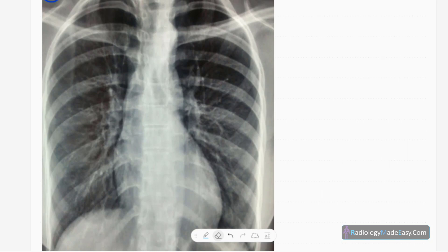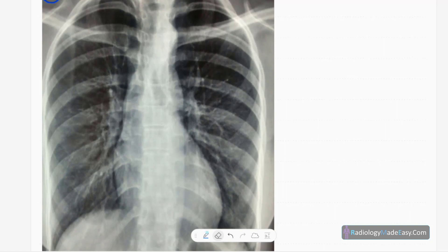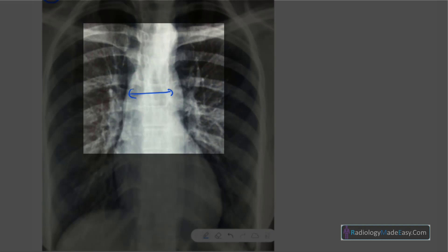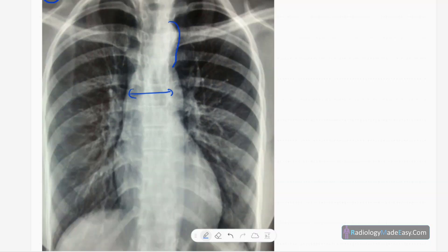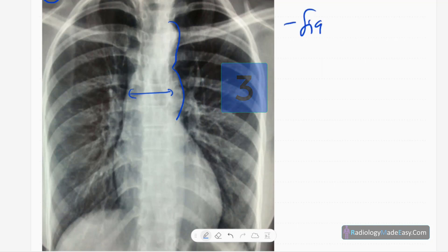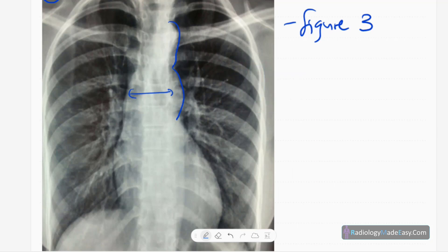At a glance you can't see any abnormality, but when you look closely you can see some subtle mediastinal widening here, and a prominent aortic knuckle also. You can see it has a figure-3 like appearance — figure-3 appearance is there. This is the aortic knuckle, and this is a focal dilatation of the descending thoracic aorta.